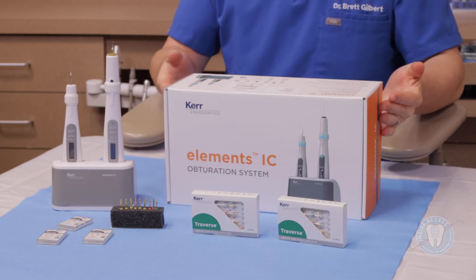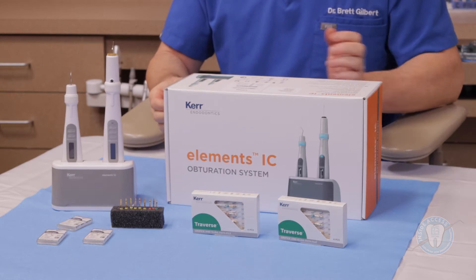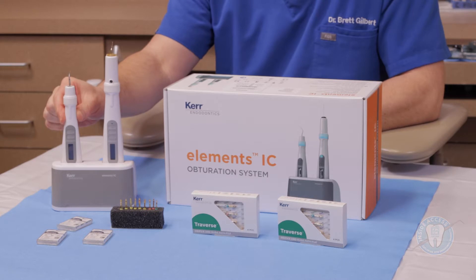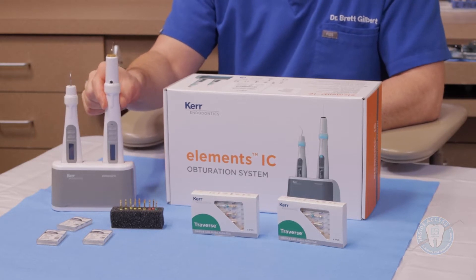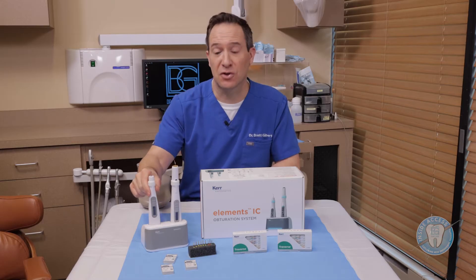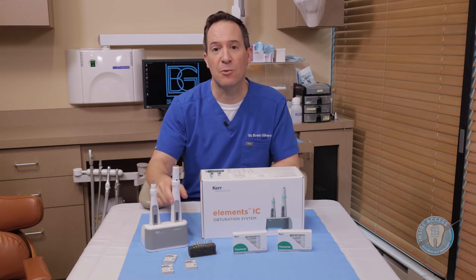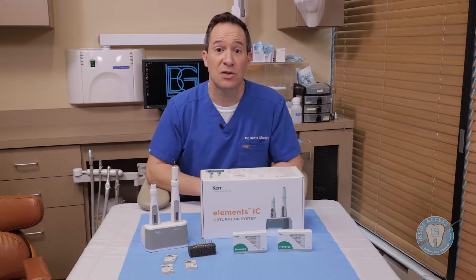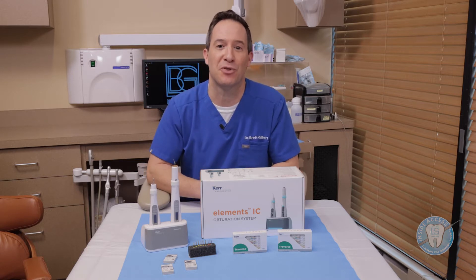Lastly, I wanted to introduce you to the Elements IC. This is an obturation system which includes both a System B down pack unit as well as a backfill obturation unit. It has a very versatile base with the ability to very easily withdraw and replace the units to allow for effective charging while they're sitting in the unit. These are products I've used in my clinical practice extensively and wanted to share them with you to see if they might help you with your treatments.